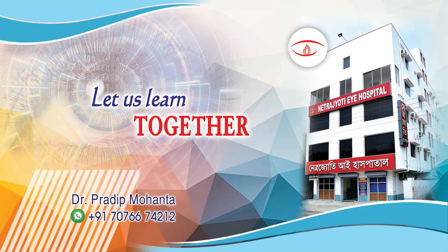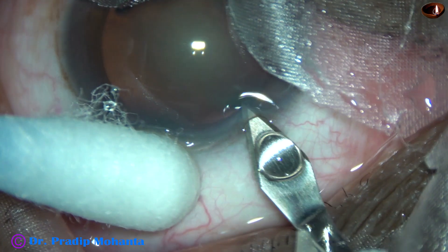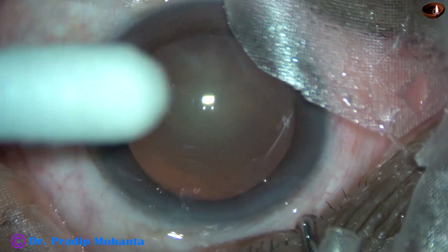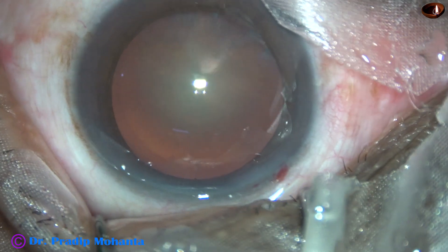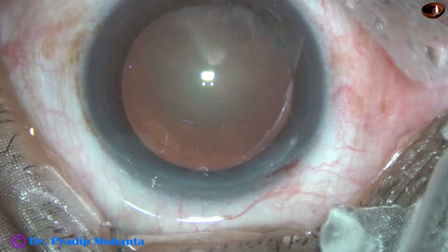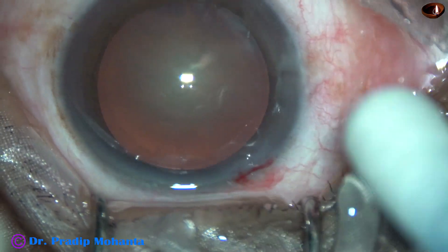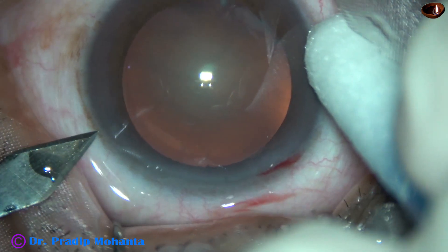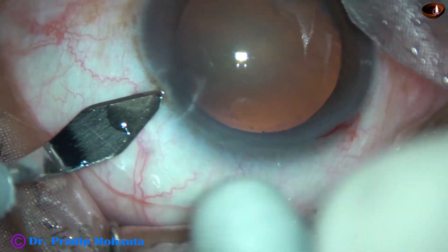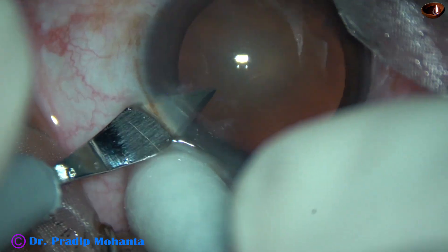Friends, welcome to my workplace at Ranaghat, West Bengal, India. In this video, I am going to try bevel down feco — that is, nucleus management when the bevel of the tip of the feco needle faces the posterior capsule. This looks dangerous, but if the anterior chamber stability is good, this is not so.